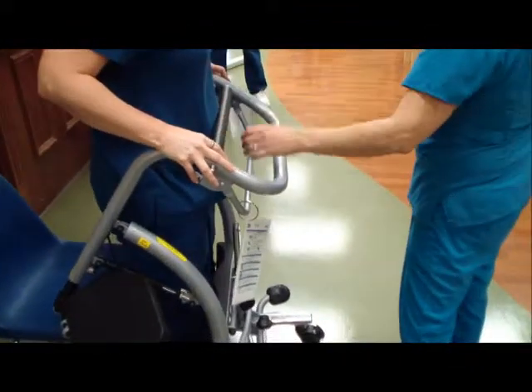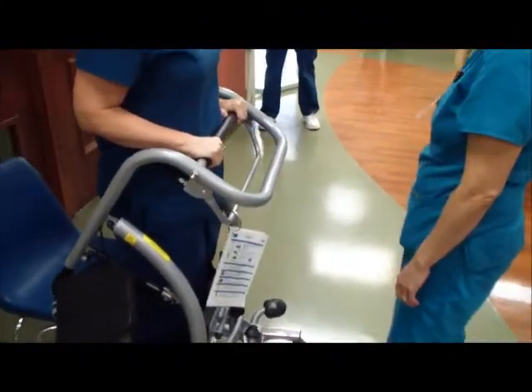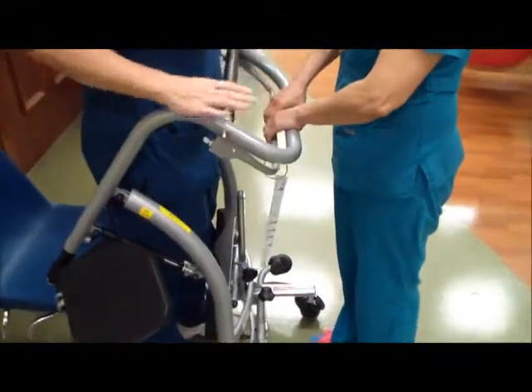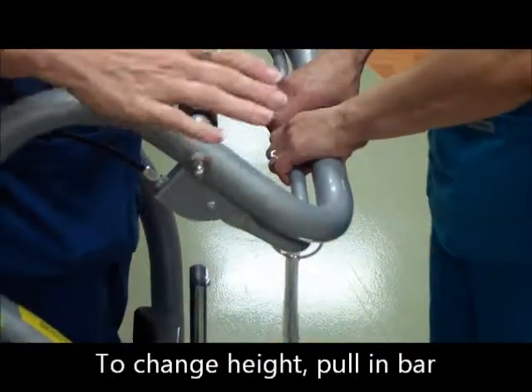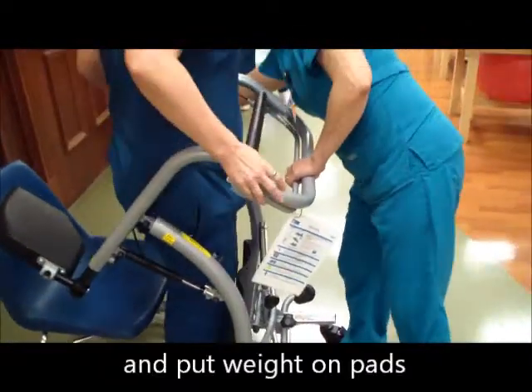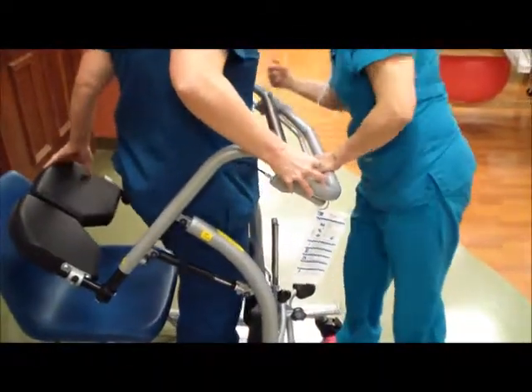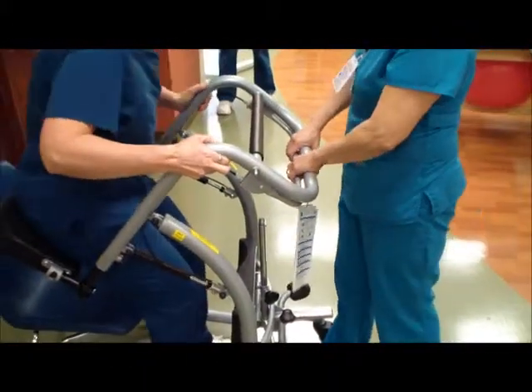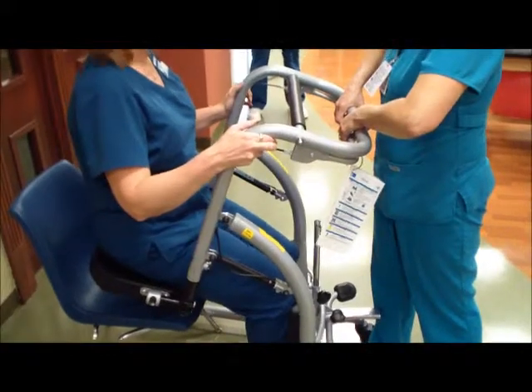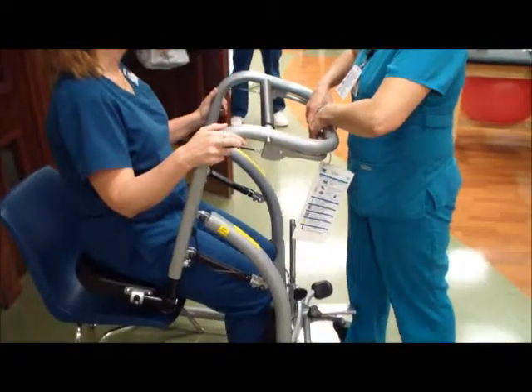And then you can put your gait belt on as well. If I need to change the angle, there we go. Put some weight in it. She has to sit back for me to be able to adjust it back. It needs the weight. It needs some weight on it.